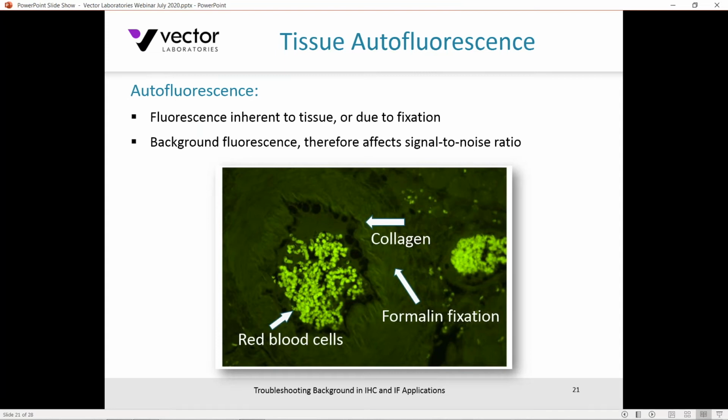Various proteins such as collagens and elastins, and certainly you do see autofluorescence induced through the use of an aldehyde fixative such as formalin, formaldehyde, or glutaraldehyde. If you do see these, they certainly are not just within the green spectrum that we've shown here. It's across the spectrum as well, into the red and far red areas.